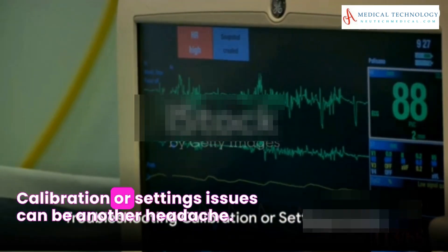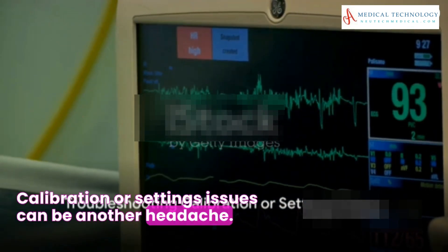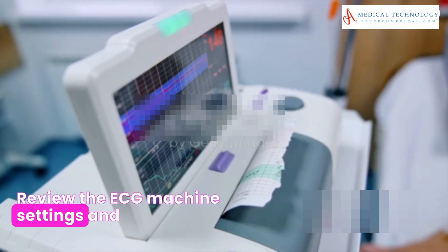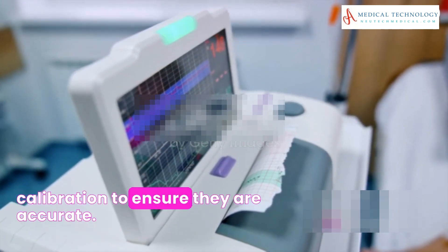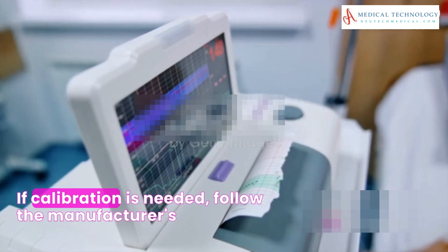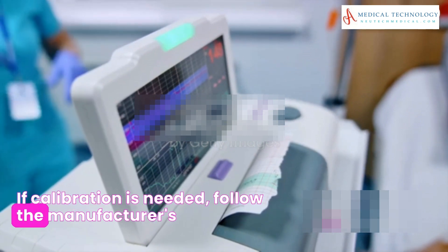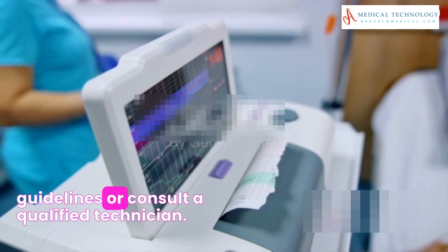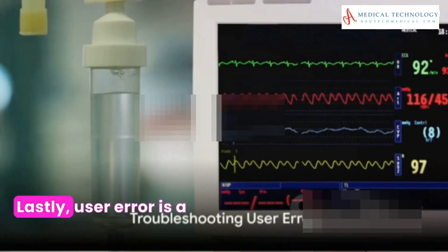Calibration or settings issues can be another headache. Review the ECG machine's settings and calibration to ensure they are accurate. If calibration is needed, follow the manufacturer's guidelines or consult a qualified technician.